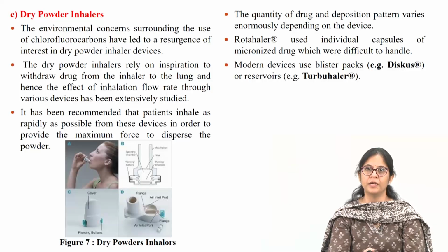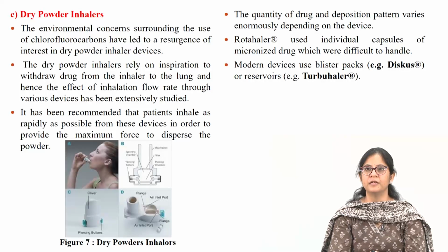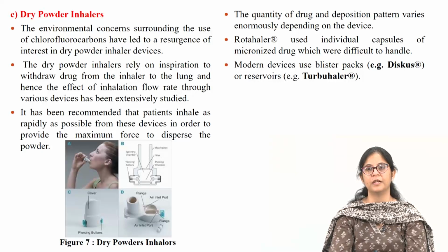The dry powder inhalers. The environmental concerns surrounding the use of chlorofluorocarbons have led to a surge of interest in dry powder inhalers. The dry powder inhalers rely on inspiration to withdraw a drug from the inhaler to the lung, and hence the effect of inhalation flow rate through various devices has been extensively studied.